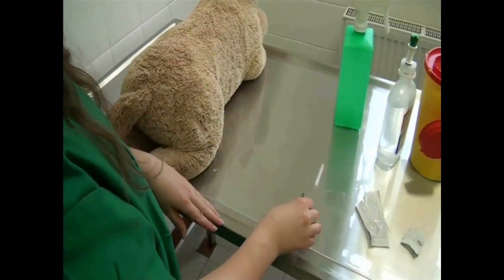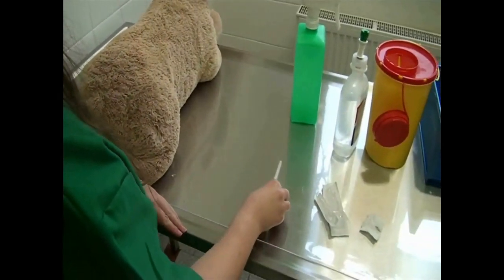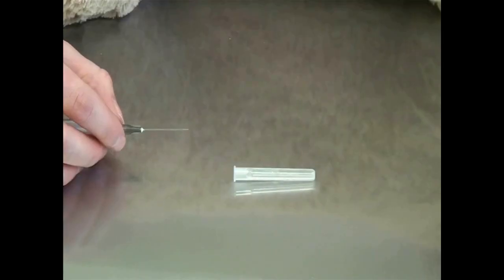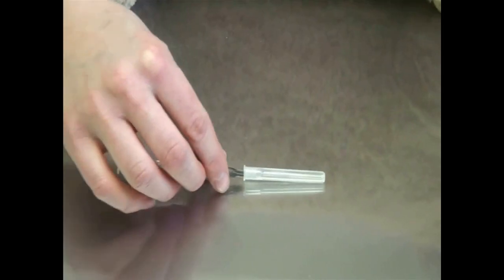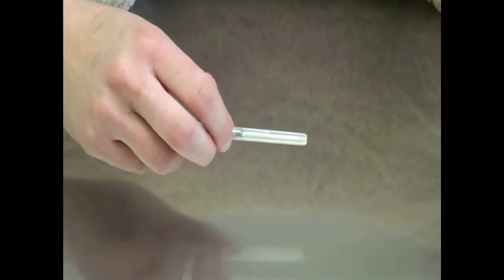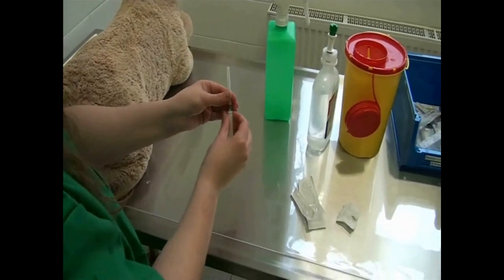Now dispose of the needle correctly. This is shown here in slow motion. Use a one handed technique to recap the syringe and then dispose of the needle and cap in a sharps bin.